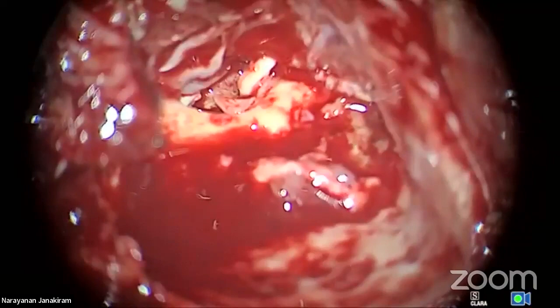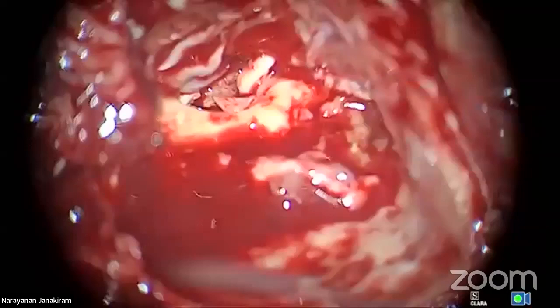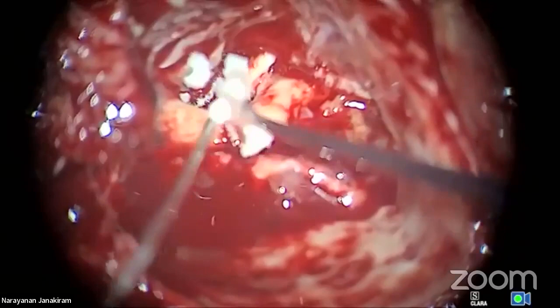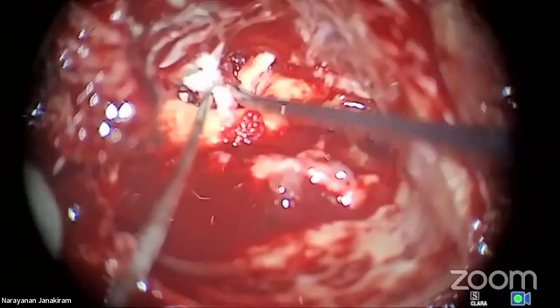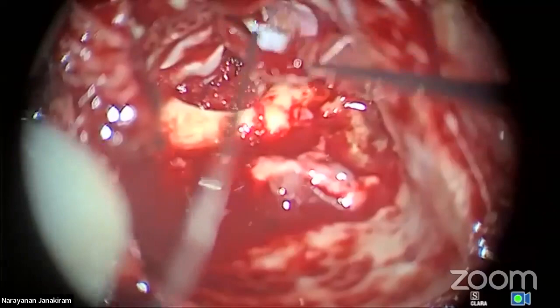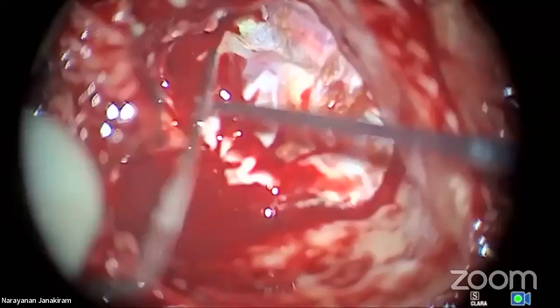Give gel foam. Okay, give me that soft tissue also. Now I'm going to stabilize that right here, anteriorly, and then posteriorly. See how beautiful mastoid surgery is. In fact, I love to be an otologist, not a rhinologist, believe me. I love otology. Now you can see that. See how beautifully there's an impression for the cartilage there.